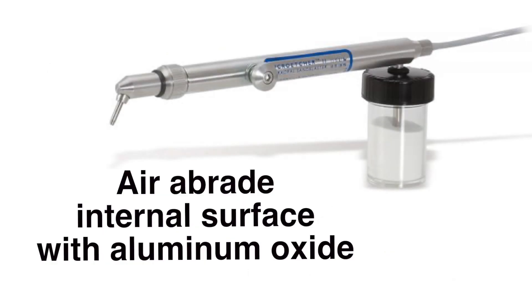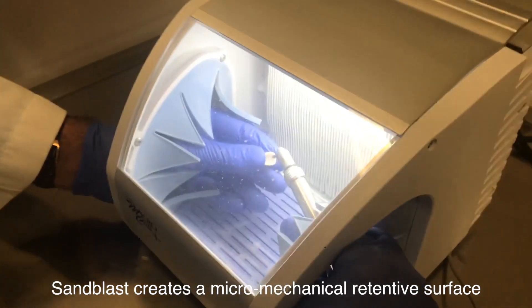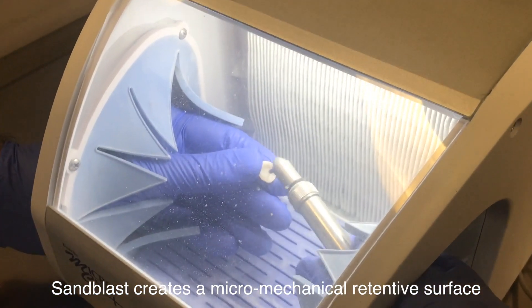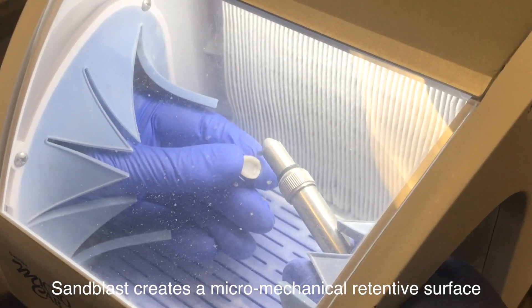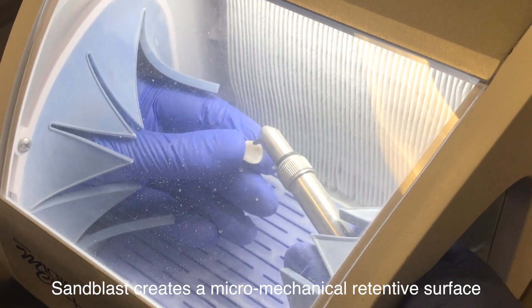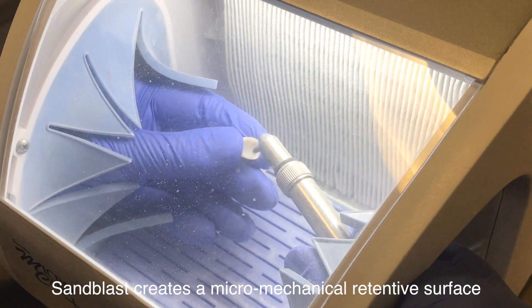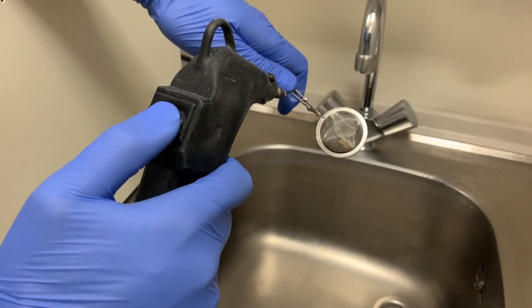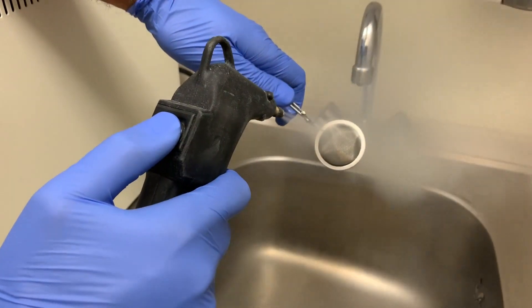Instead, the internal of the restoration should be prepared with a 25 to 50 micron aluminum oxide sandblast. This sandblast will create a micromechanical retention on the internal of the restoration. After the air abrasion process, clean the internal of the restoration with either a steam cleaner or an ultrasonic bath.